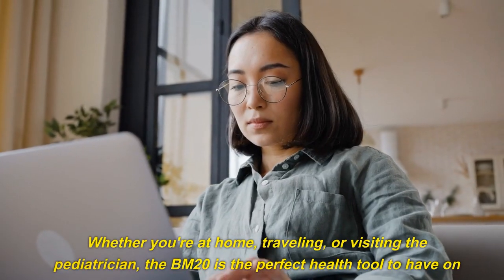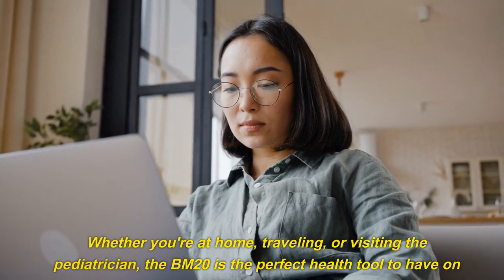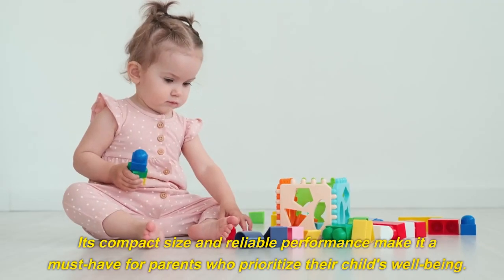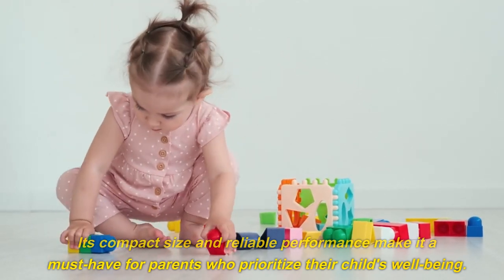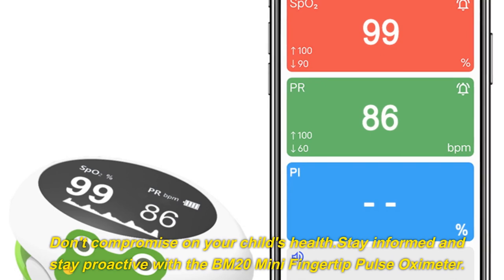Whether you're at home, traveling, or visiting the pediatrician, the BM20 is the perfect health tool to have on hand. Its compact size and reliable performance make it a must-have for parents who prioritize their child's well-being.